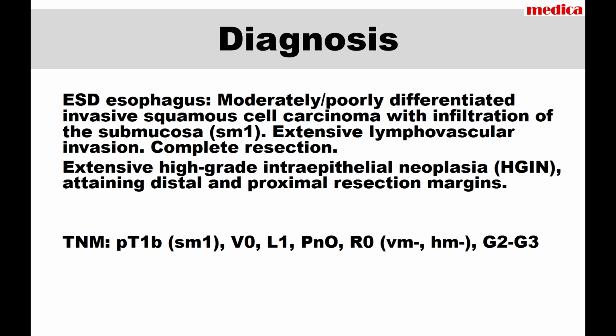But in the first image, second image, we can see some differentiated area. So it looks like upward growth. But in a depressed area, the vascular structure becomes very unclear and almost amorphous on the surface. So it strongly suggests a moderately or poorly differentiated squamous cell carcinoma, and such a lesion automatically increases the risk of lymphatic invasion.